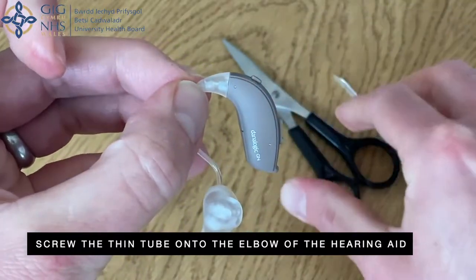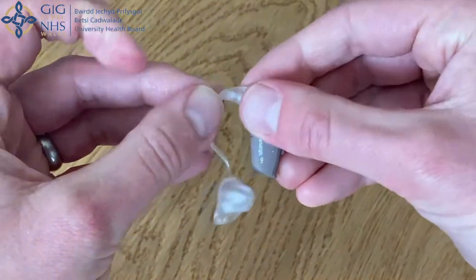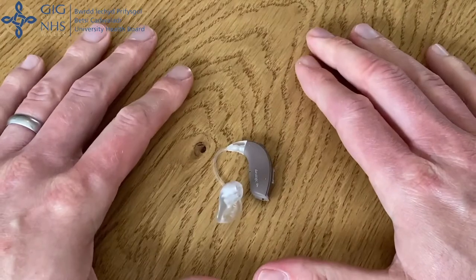You can cut the needle from the ear mould. Roll the tubing from the ear mould.